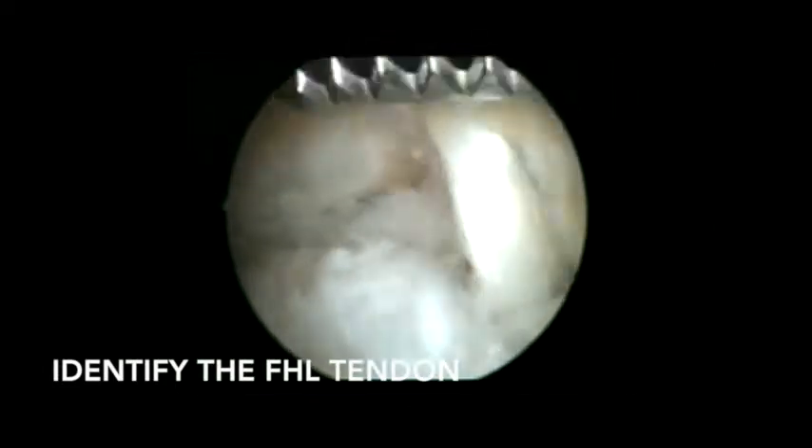The patient is placed in prone position. Endoscopic portals are used as described by van Dijk, with vision in the posterolateral portal and a 3.5 millimeter shaver in the posteromedial portal. We begin by shaving the crural fascia.